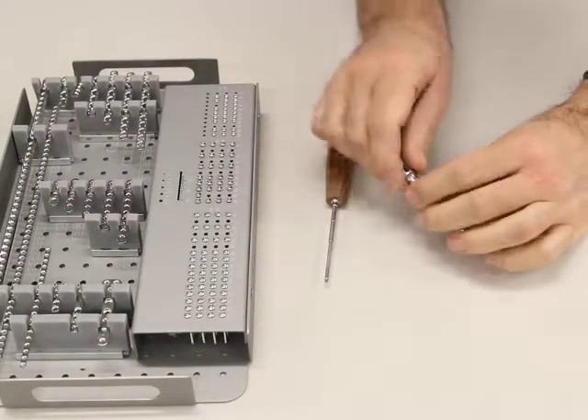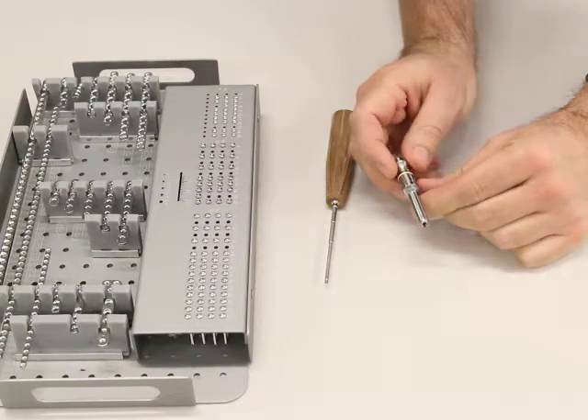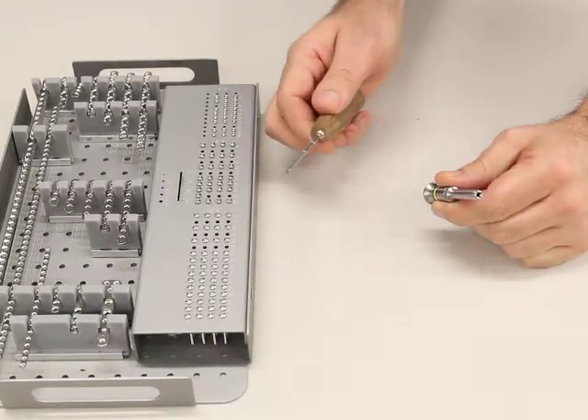Just a quick demonstration on how to use the Knight Benedict screwdriver holding sleeve. This is a 2.4mm holding sleeve with a 2.4mm hex driver.